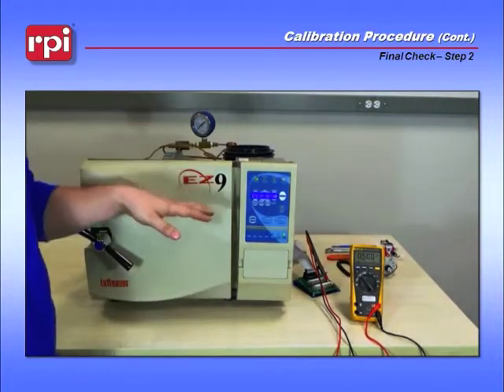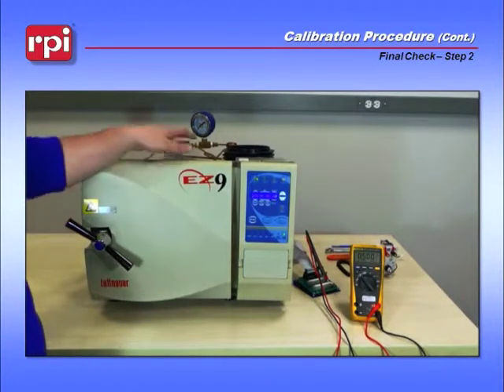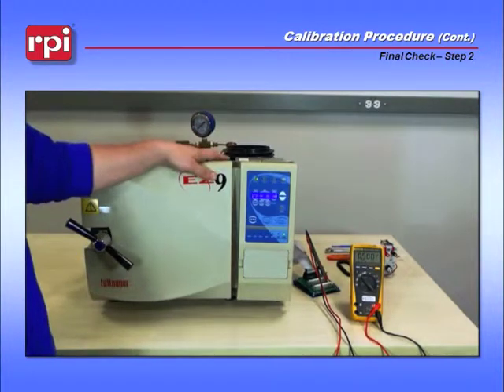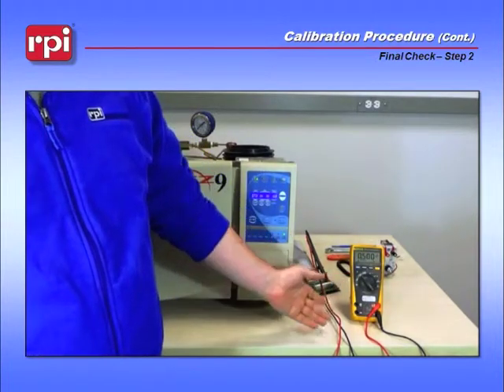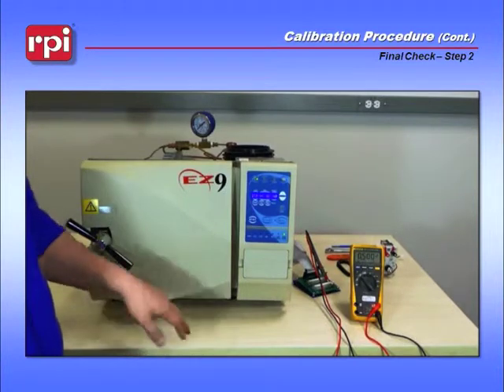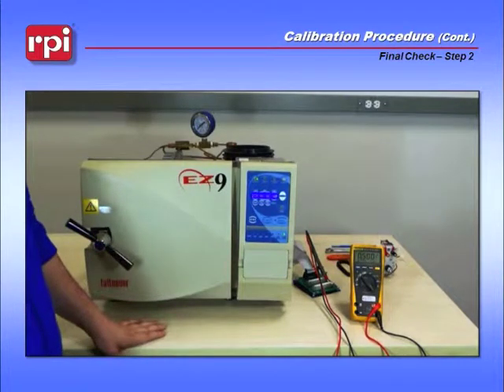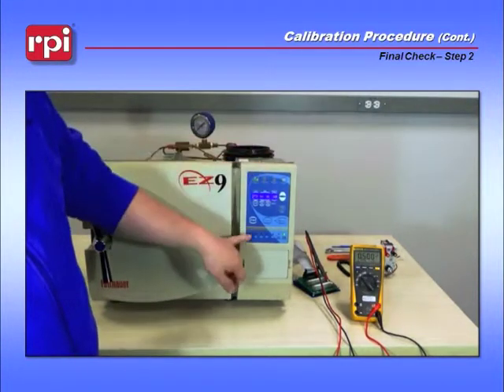As you run the test cycle, pay attention to a few things. First, at 194 degrees, the air outlet valve in the back of your reservoir will close, which will allow you to build pressure. At that point, you'll begin seeing your meter rise from 500 millivolts to 1.5 volts DC approximately once you reach 30 psi. If you do not reach 1.5 volts or approximate to that area, you'll need to recalibrate your machine. Push unwrapped and then push start.